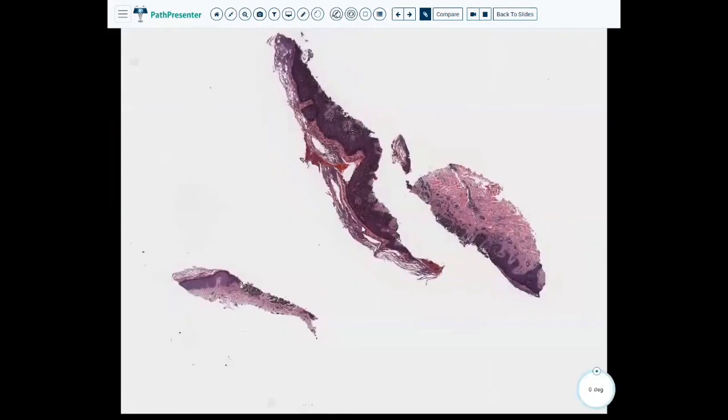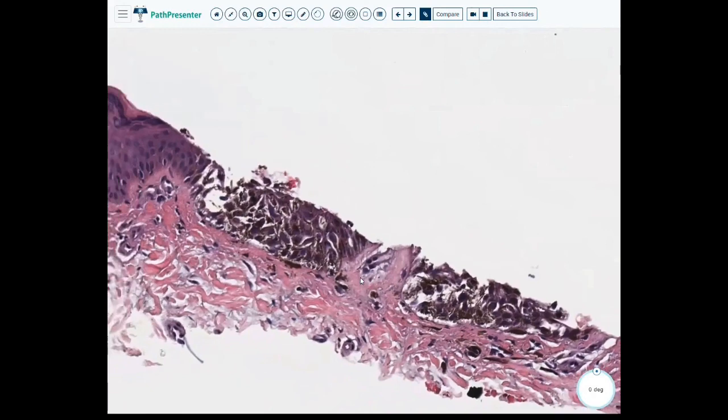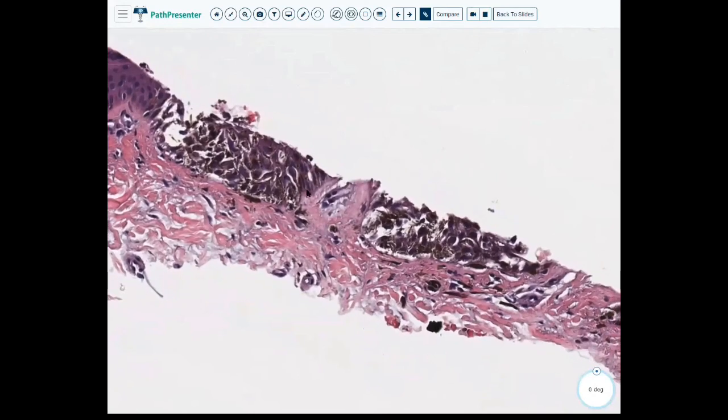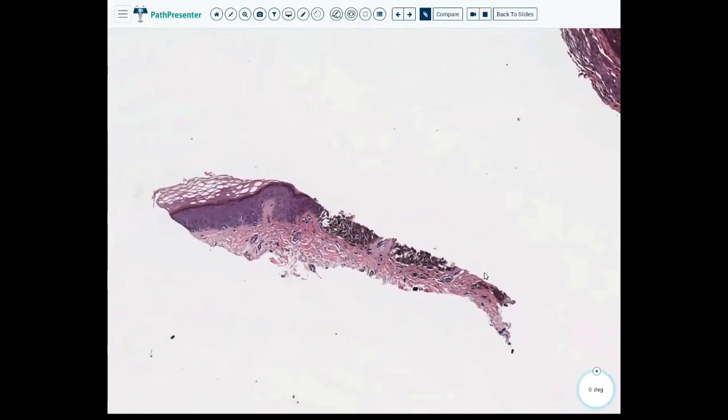Case 12. And this looks like maybe it's either super darkly stained, which happens sometimes, or it's really intense pigmentation, because this looks like that was stained okay. So let's just take a look at this piece, which maybe doesn't help us all that much. There's a lot of pigmentation for sure. But we can't say too much about these cells.